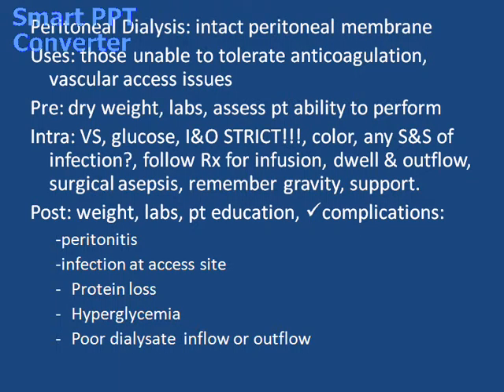And anyone who has an advanced age, which is our elderly population, they have even further complications related to chronic illness, so they're at higher risk. We want to make sure also that when the client assesses the site for leaks, that they don't tug or twist the tubing of their site.